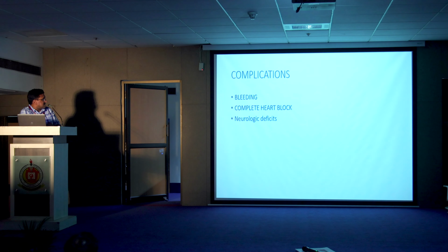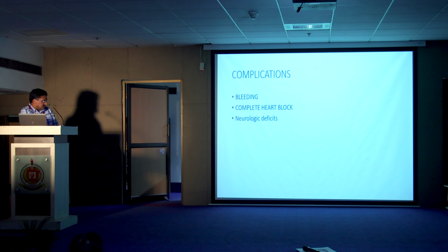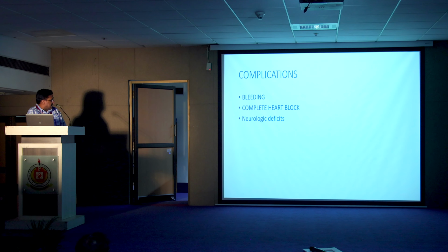Coming to the complications, the dreaded complication of aortic valve replacement is bleeding, which can be dealt with by closure of the aortotomy securely with a pericardial patch or taking a normal aorta.